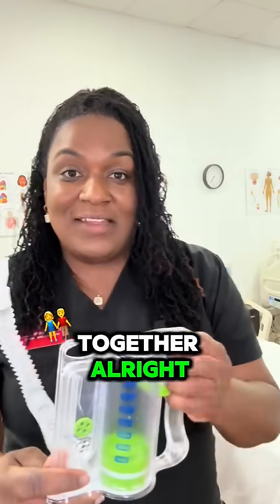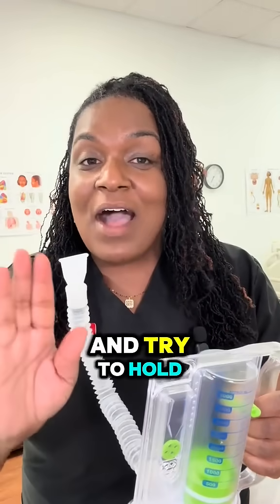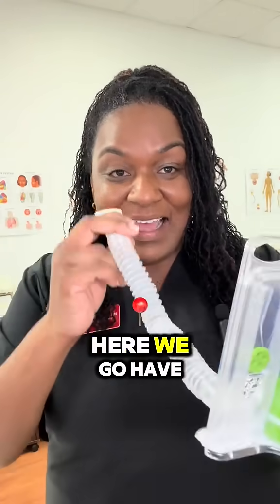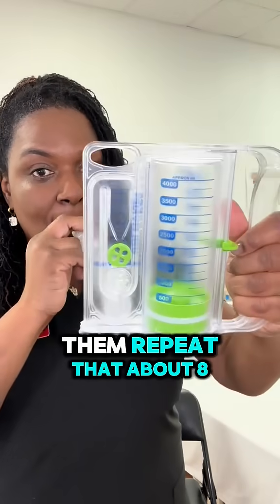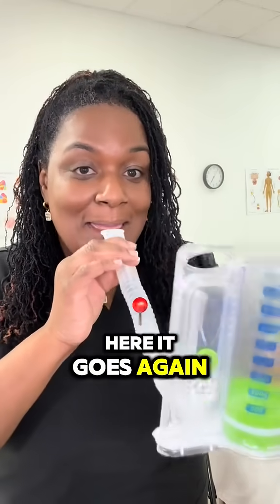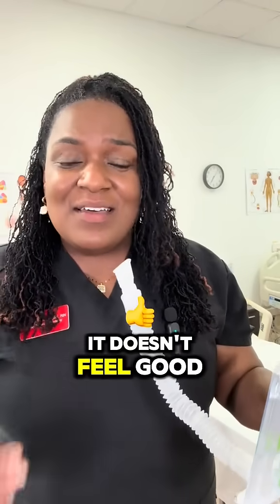Let's do it together. Eunice, I want you to take a deep breath in and try to hold it for three seconds. Okay, here we go. Have them repeat that about eight more times. And now your patients start to cough. It doesn't feel good, but that's part of the healing process.